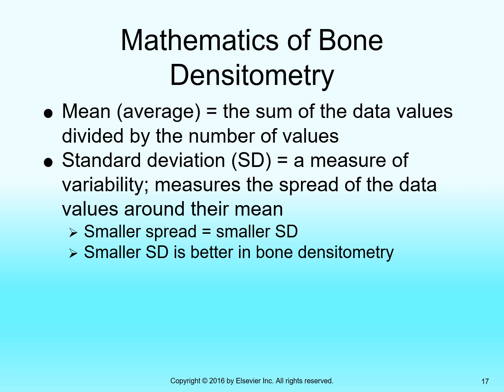By means of taking an average, you decrease the variability. The average is closer to the true measurement than any individual measurement. And the more measurements you take, the more truthful the average becomes. Okay? A standard deviation is a mathematical manipulation that's going to tell you about the variability of your measurements.